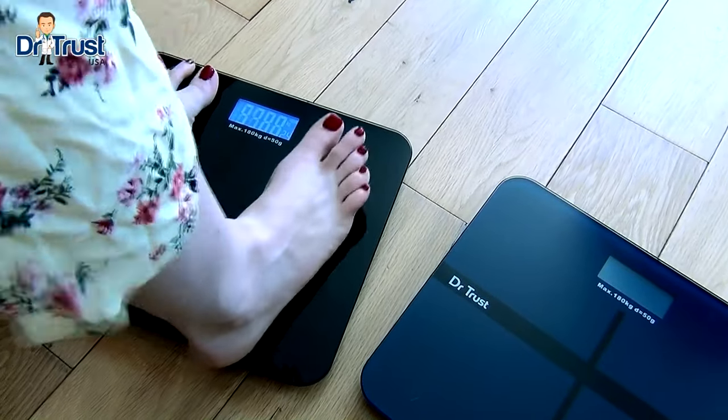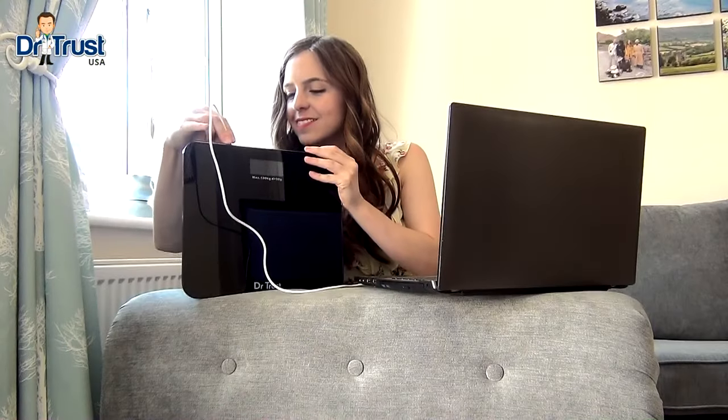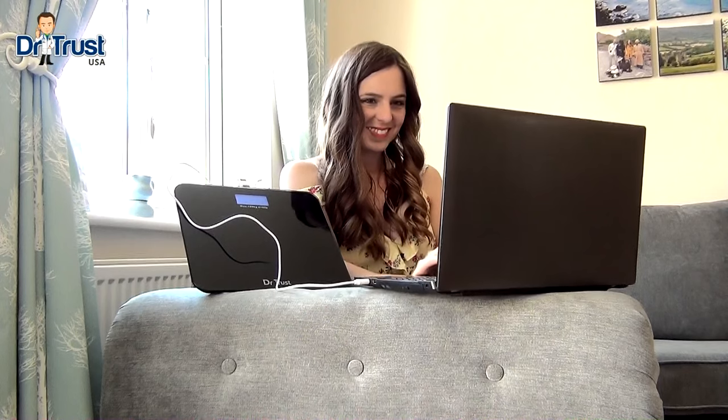The scales can hold up to 180 kilograms and feature a long-lasting rechargeable battery and included USB cable, so you can charge your scale when you're at work, play, or even shopping online. Simply plug in at the top of your scales and you're ready to charge.